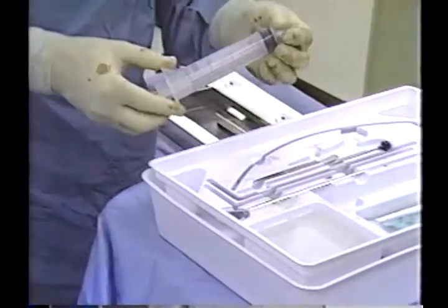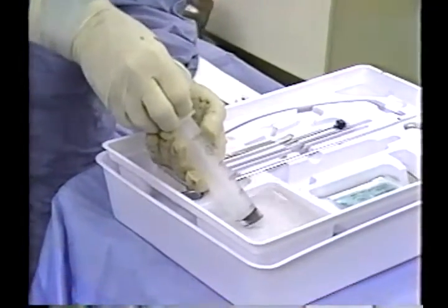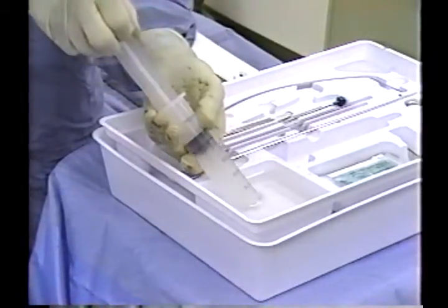With the 50 cc syringe supplied in the tray, heparinized saline or dialysate is infused into the abdomen at this time.